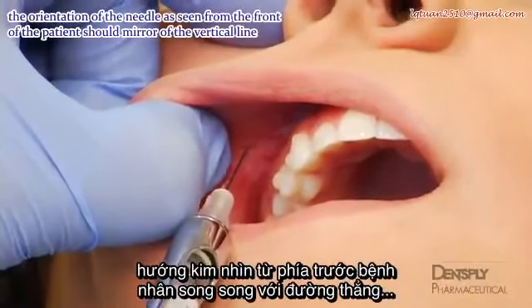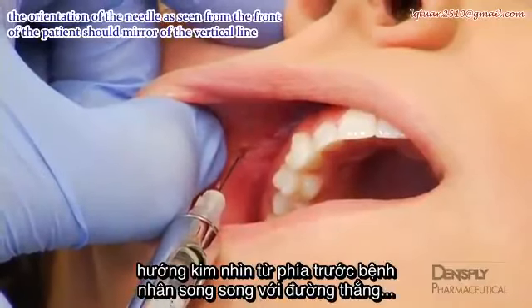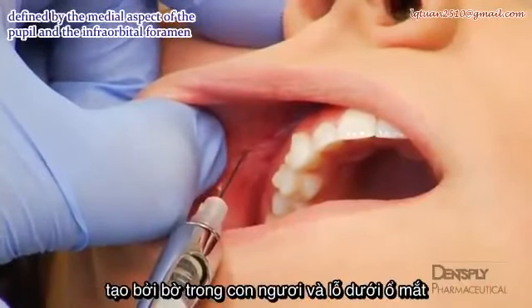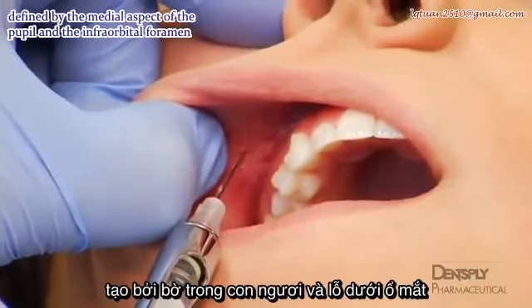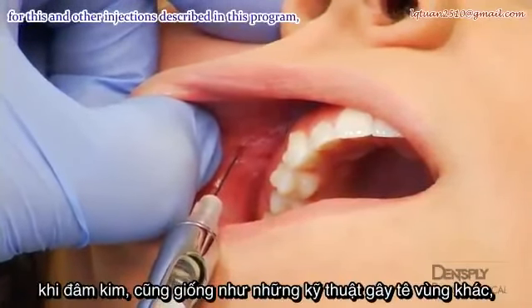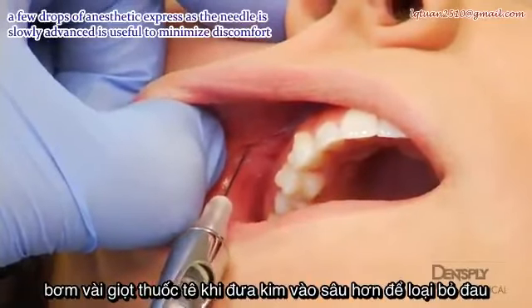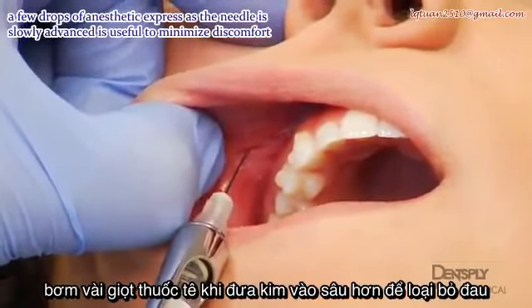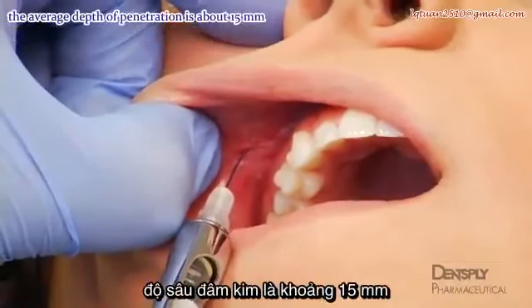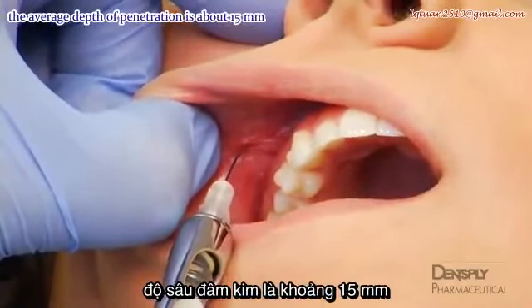The orientation of the needle as seen from the front of the patient should mirror a vertical line, defined by the medial aspect of the pupil and the infraorbital foramen. For this and other injections described in this program, a few drops of anesthetic expressed as the needle is slowly advanced is useful to minimize discomfort. The average depth of penetration is about 15 millimeters.